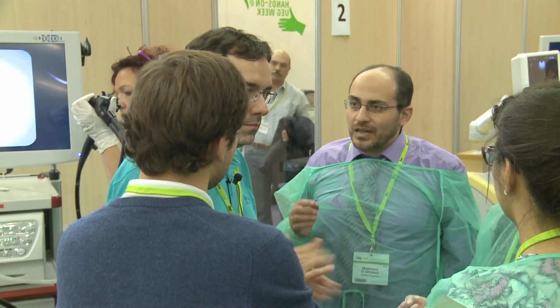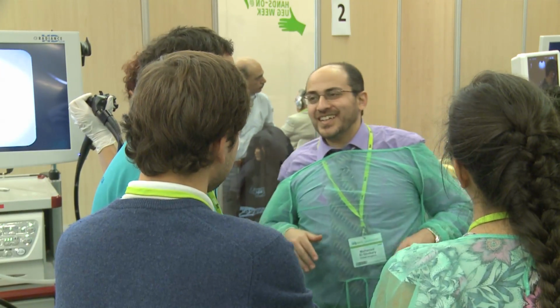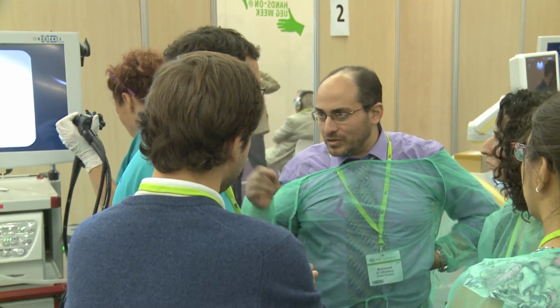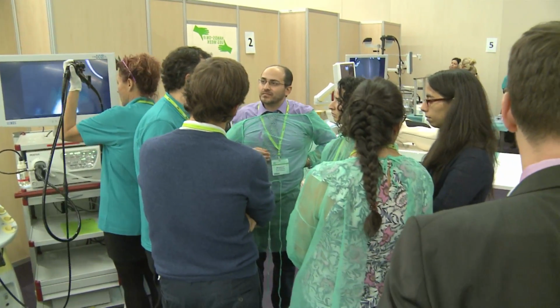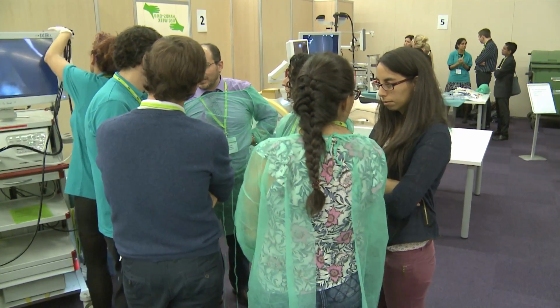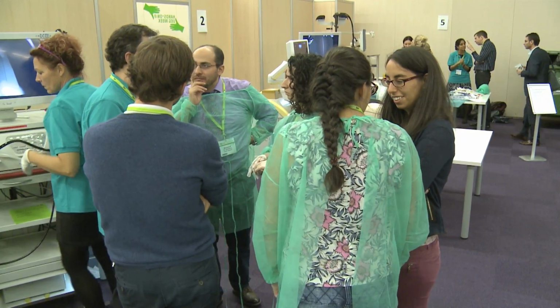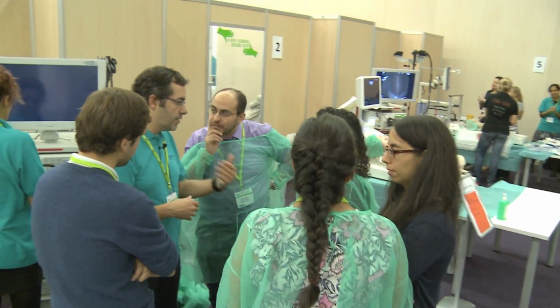Okay? Submucosal masses. Tell me, what's your strategy? Discuss with the surgeon, always. Never do anything without the knowledge of the surgeon. Whenever I take an FNA, I will always go for a ProCore. Always. The bigger, the better. Or if not, sometimes I'm now using the 19 Flex of Boston. But preferably, the ProCore. However, we are targeting less and less subepithelial lesions.